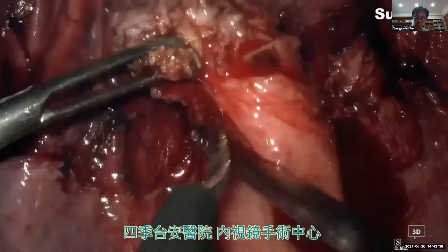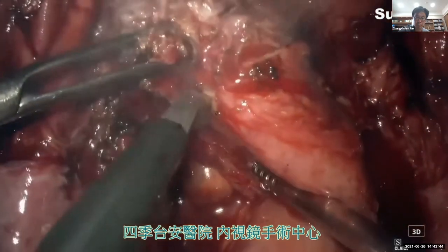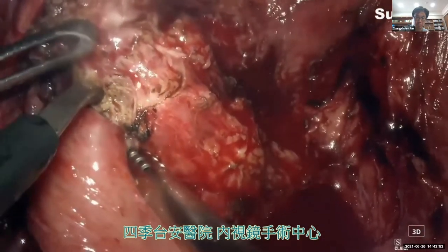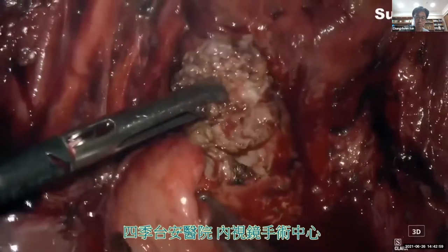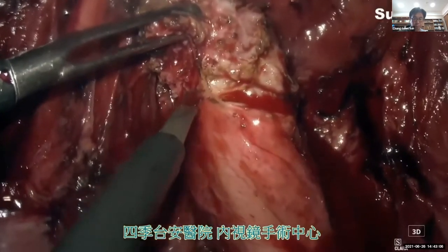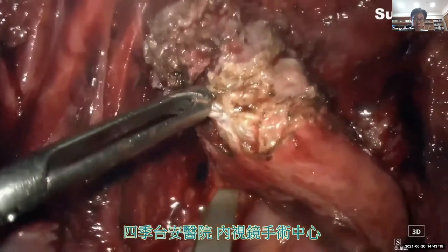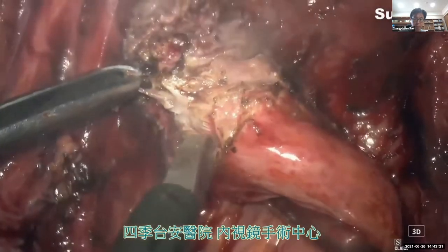Now we are approaching the proximal part of the DIE lesions. Make an incision. Try to find out the correct cleavage plane. Try to find out the junction between the nodule and the normal tissues. We can still feel some hard nodule underneath, so we have to make a new incision line here. Again, traction, counter traction. Monopolar cutting current, short burst.